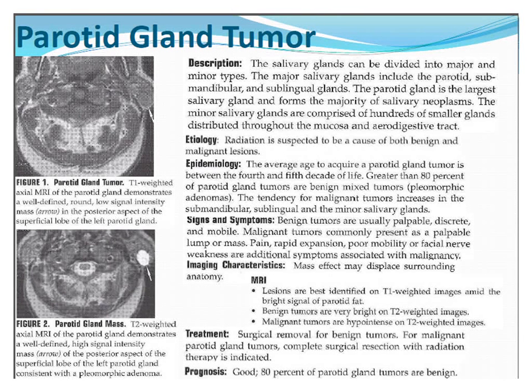Sometimes these are idiopathic. Sometimes they mention radiation as a possible cause. Sometimes the patient will notice these as a swelling on the side of their face, or sometimes they may just be discovered incidentally during imaging that's done for another reason. So it might be helpful to give contrast if it was an undetected lesion and they weren't planning to give contrast for that one.